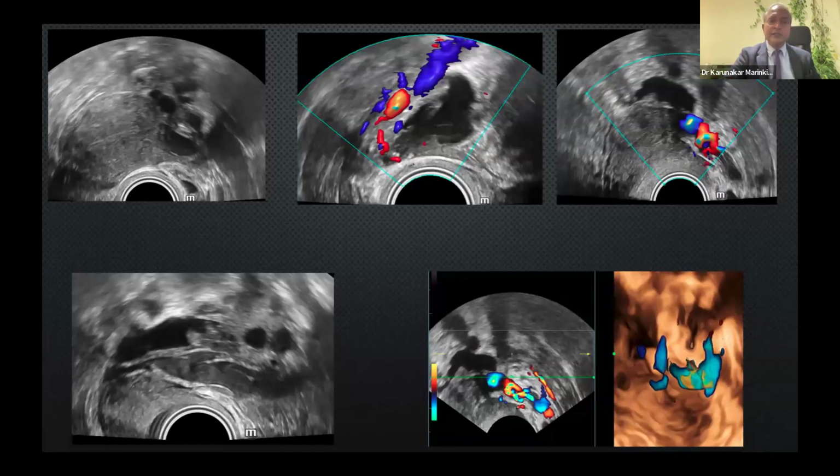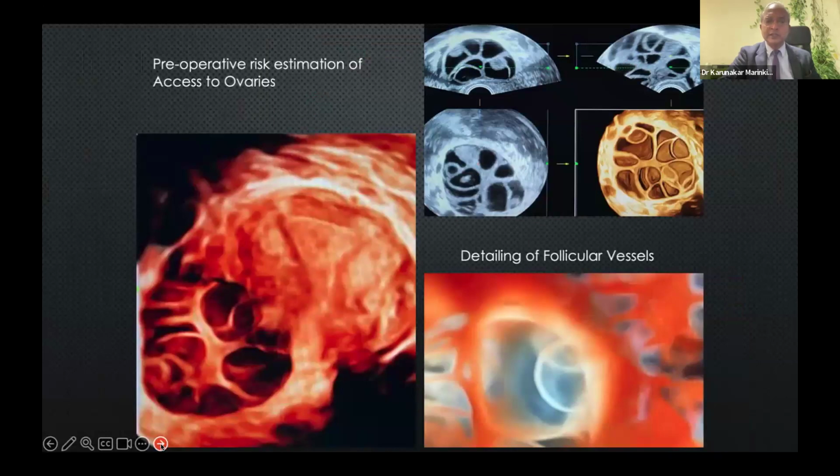Going, seeing, just kissing structures by tapping them on their face. A lot of laparoscopic surgeons are not good. They just go, they do something they are not scared of, and then they get out. So you must know why you need laparoscopy. When there are inconclusive adnexal pathologies, that's when you take the route and use your better colleague, because there are greatest surgeons in every country, but you must learn from them. Okay. So sometimes, you can't access ovaries.